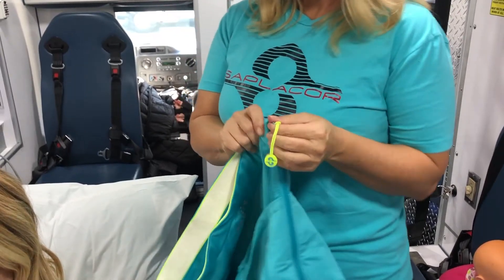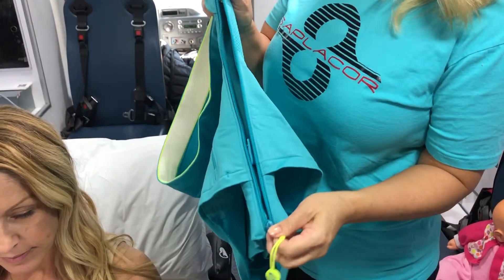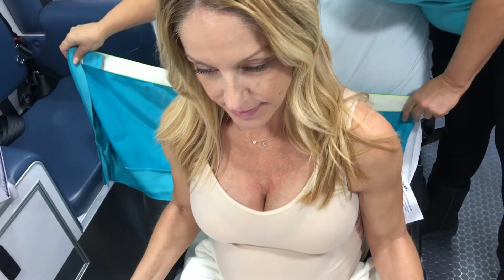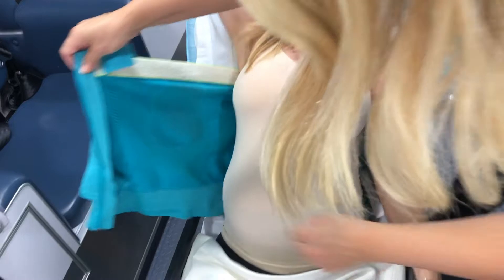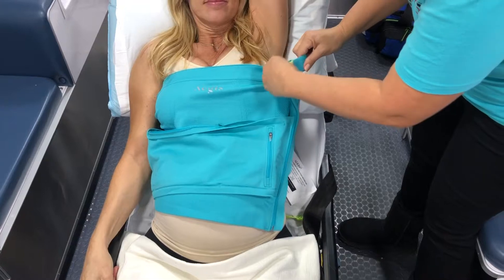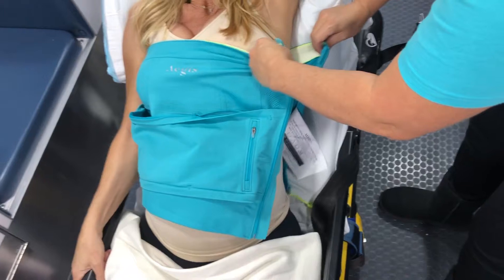While the mother is sitting on the ambulance cot, unzip the Aegis Wrap and place behind the patient's back. The zipper will be on the left side of the patient. Lay the mother back and pull the front of the Aegis Wrap across her torso. Secure the top and bottom eye hooks under her left arm and side. Zip up the wrap completely to confirm a proper fit. The Aegis Wrap should be snug but not tight.